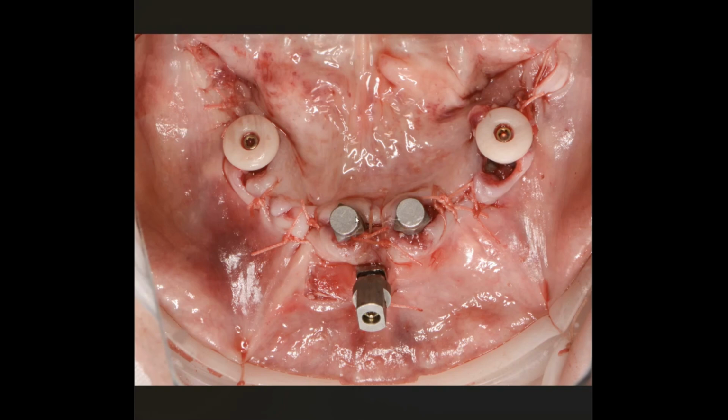And I believe these are DES 018 scan bodies, if I remember correctly. I've been using these things since I started with digital workflow. I still have the same ones in the office. We've been using them for years. They're 018s, and I use them because they're tall. They can get over top of thick tissue. They scan very well and they give us excellent results.